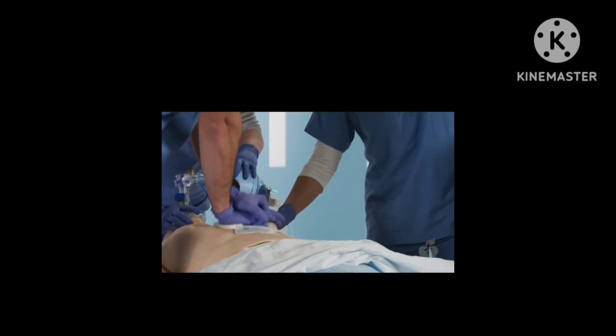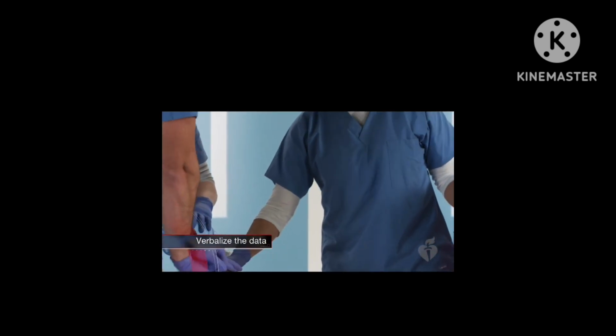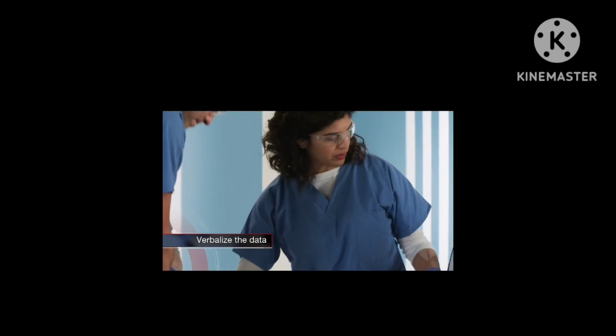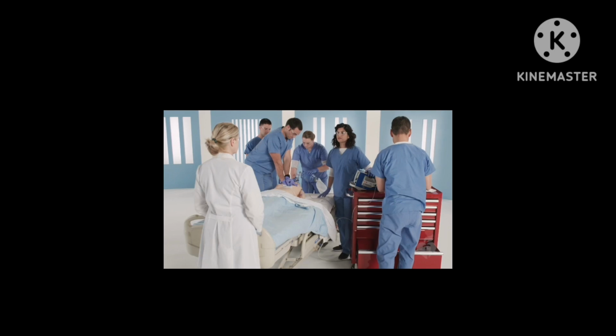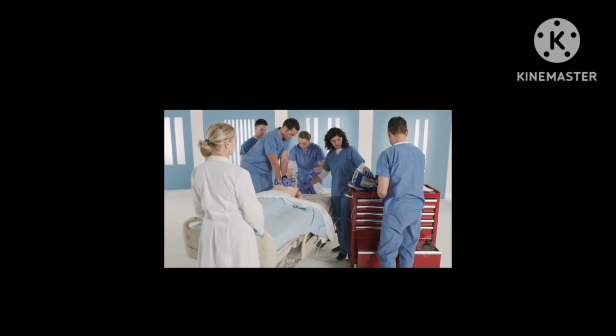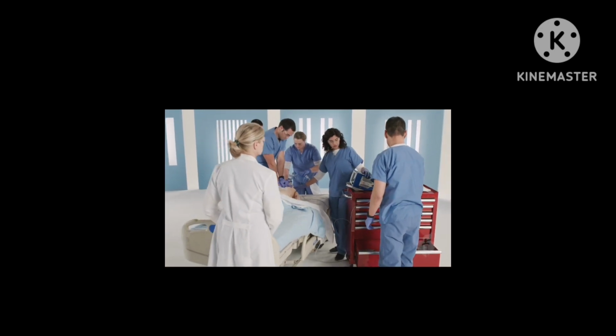Now that the CPR coach is in place, they should verbalize the data from the feedback device, providing corrective and positive feedback, such as push harder or your rate is good. Great job, you're right on target.